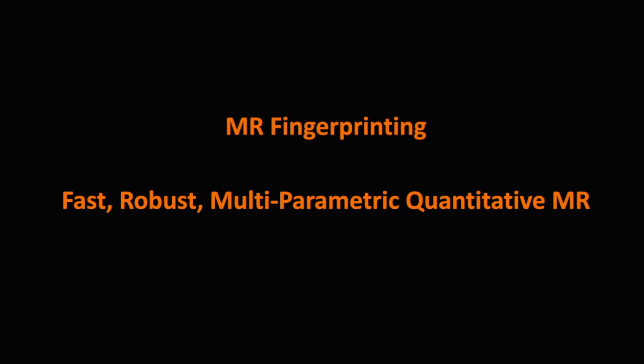Multi-parametric is a way to improve the scan efficiency. If we're able to quantify multiple tissue properties from a single scan, we don't need to worry about image co-registration or motion during the scan, such confounding factors downstream. So this is our general goal of developing MR fingerprinting.